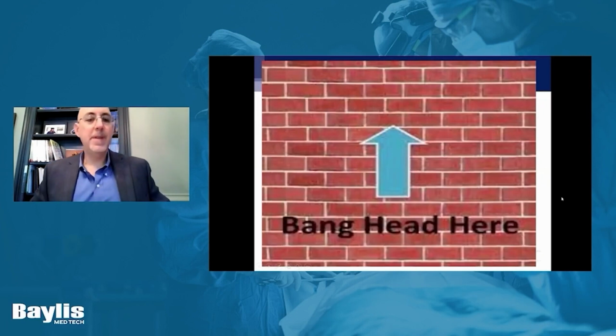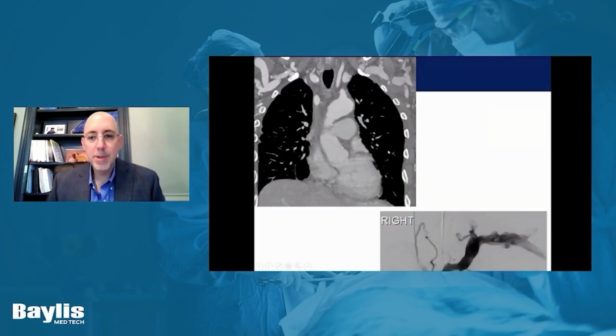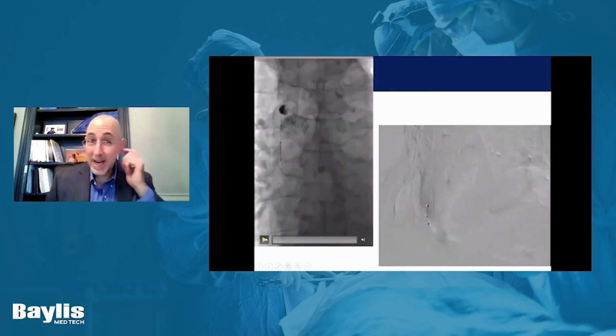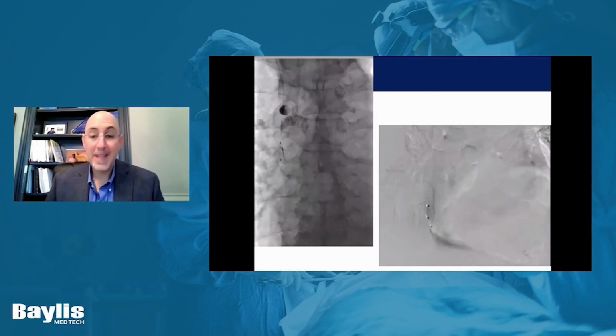Now, suppose you've done all that and you are not able to cross antegrade. So what now? Well, here's an example of a patient with a long segment SVC occlusion, absolutely nothing getting through. I was not able to get through with an 035 catheter, so I converted to an 018, and it passed right through, and I was like, perfect. Well, except when you do your run, which you always do before you intervene, that's not the right atrium. In fact, that's a pericardiogram.